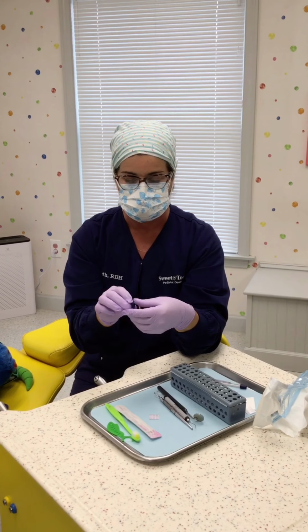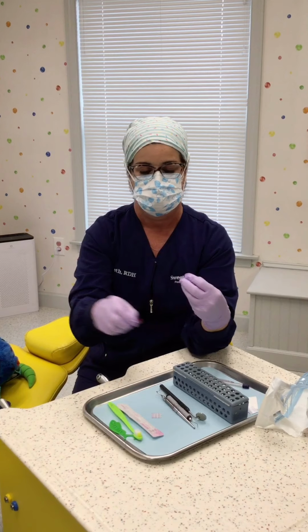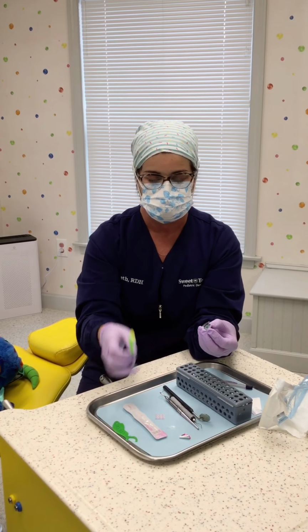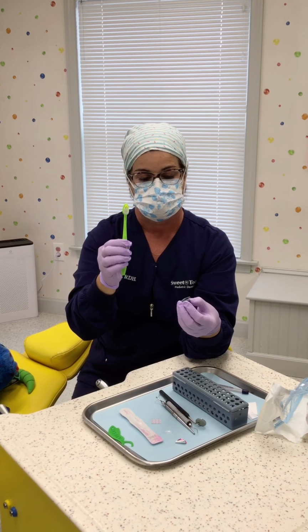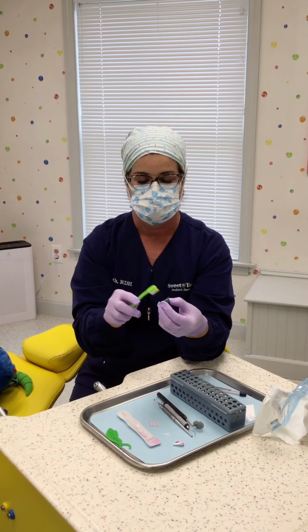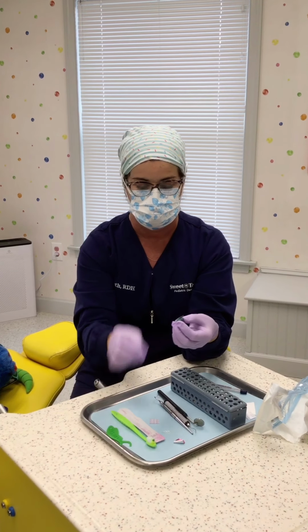I also took out some toothpaste. I actually grabbed some strawberry. I'm going to open this one up. And these days what we're doing is we're using a regular toothbrush to be able to brush teeth. So I'm going to put a little bit of toothpaste, just kind of pretending right in through there, that we would be able to just put a little on and be able to brush around. And I'll show you that in a moment too.